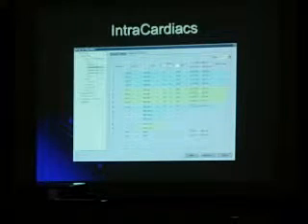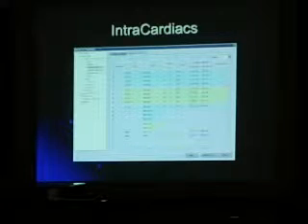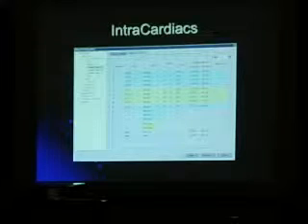Our gain settings, remember what I said, it's 1,000 for everything except for your HIS and your ablation. We go ahead and set those at 2,500 because those are places we're specifically looking for little itty-bitty tiny signals.